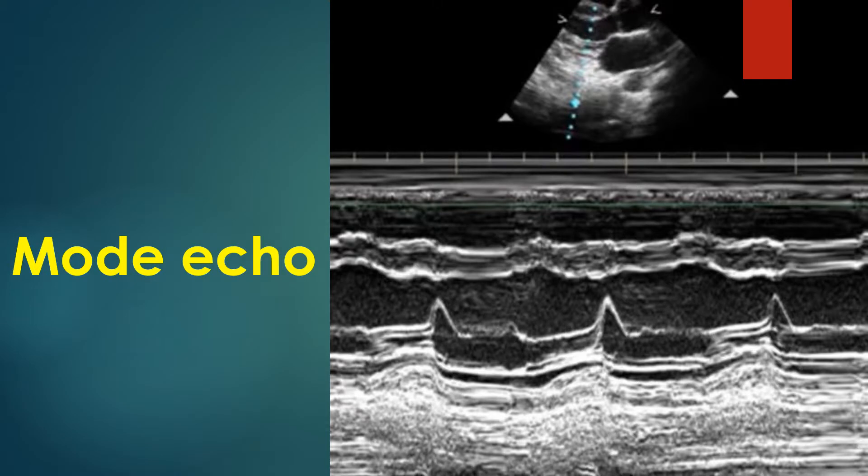M-mode examination was the initial mode of echocardiography and has been largely superseded by other modes. It is still used for taking measurements of the left ventricle to calculate the ejection fraction. The M-mode cut is taken at the chordal level for this purpose. The interventricular septum moves downwards in systole towards the left ventricular cavity.